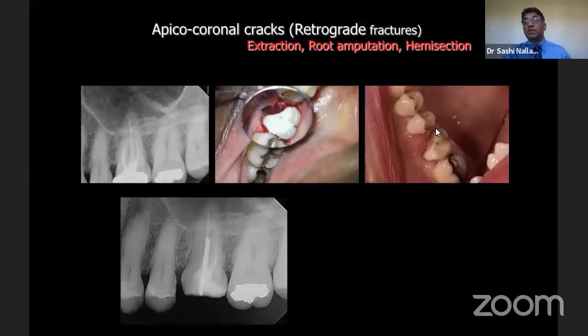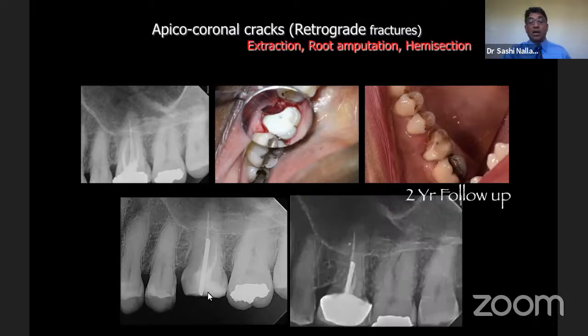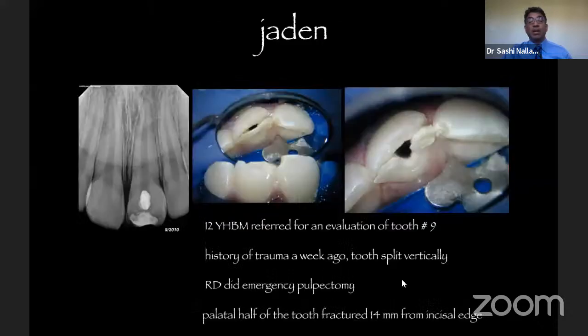So here it is after a few weeks. Everything looks pretty good. Then the dentist went ahead and placed a crown. So this is a 2-year follow-up, minus the mesiobuccal root. The tooth is doing very well, and the periodontium is looking very healthy, and the patient is happy at this time. We don't know how long these things last, but so far so good.